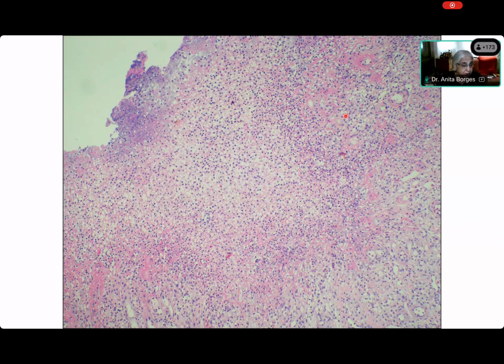But now, who was describing this? Deepali, you were describing it. So now, what do you see here? We're doing a seminar on spindle cells, right? Do you see spindle cells? No, ma'am. Here, proliferating capillaries and fibroblasts are seen. Proliferating capillaries and fibroblasts. If you are able to see fibroblasts, my dear girl, then you are looking at spindle cells. So can you see? Come here. No. So what are you seeing here?